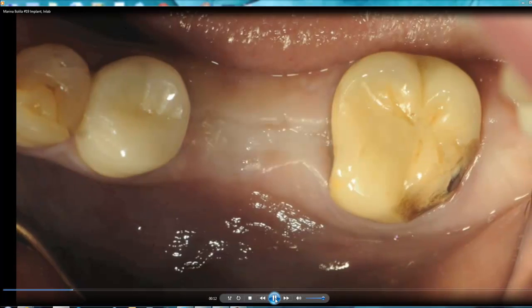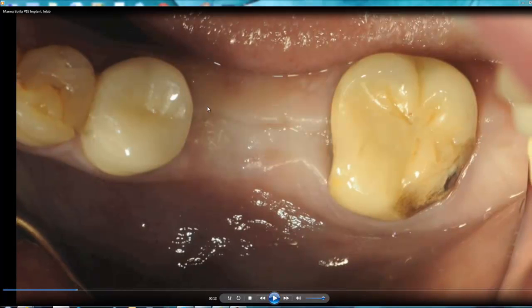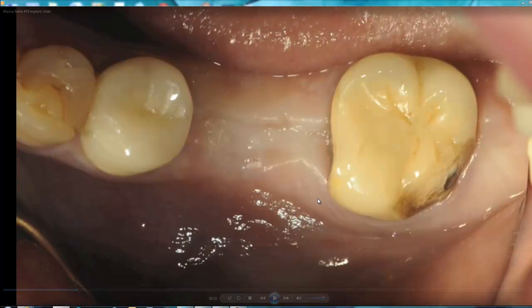On the next picture you can see how the site healed. We lost some of the width of the original bone, but we had enough width to place a 6.0 by 11.5 mm implant by MIS.